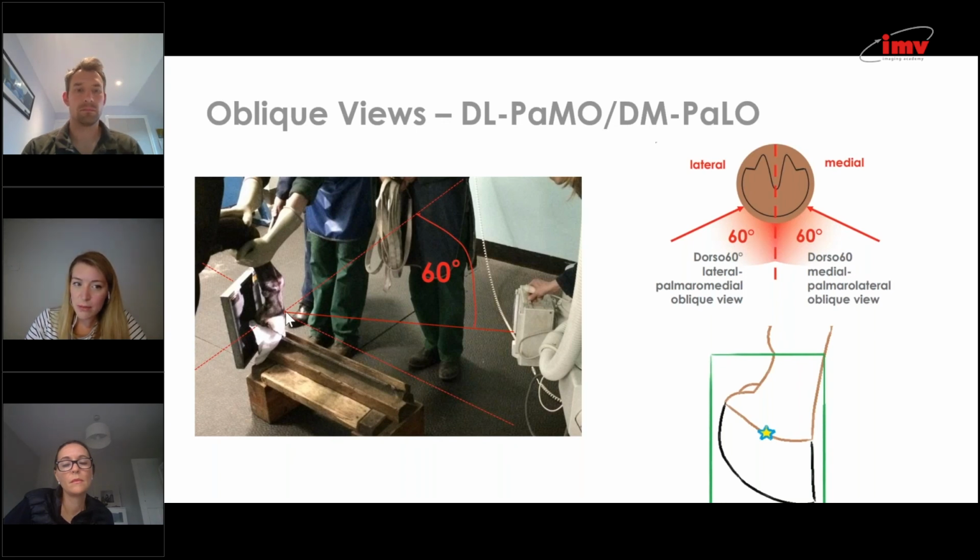If you were to do a dorsomedial oblique, I find it sometimes easier to come from the palmar aspect rather than coming from the dorsal aspect. Similarly to if you're doing a hock or something, because then you're not crossing the horse, it gives you better visualization. If you do that, it's really easy to center too high and cut off the toe.